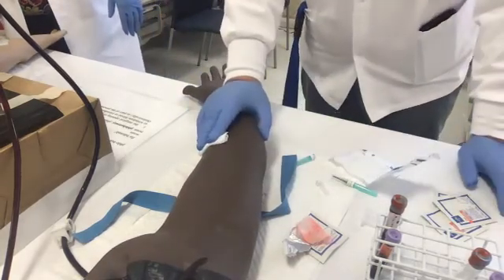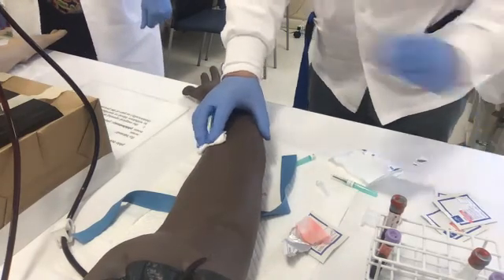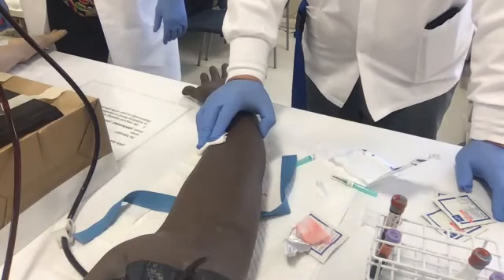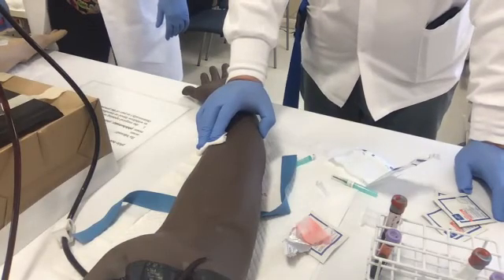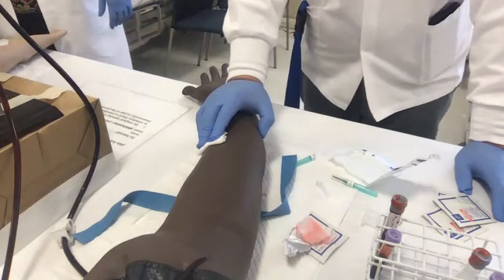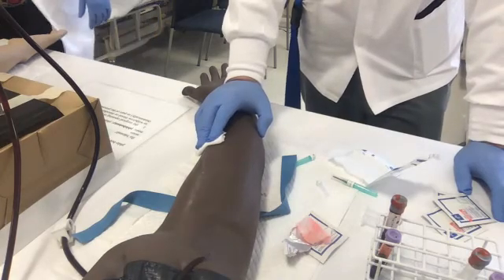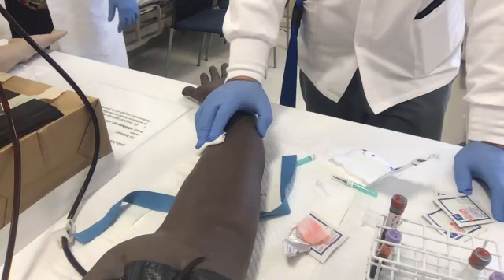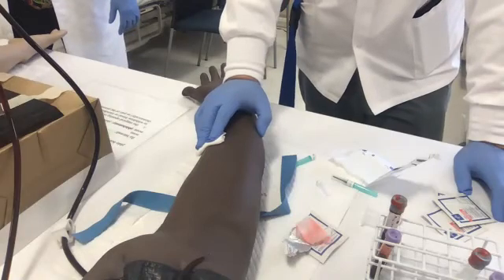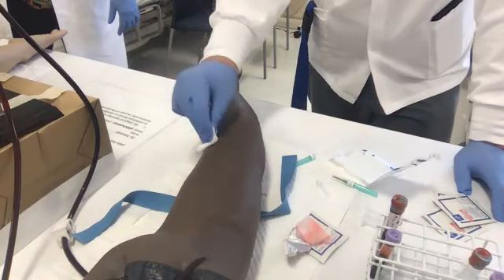Now, if for 1 more minute the patient's blood isn't controlled, you have the patient raise their arm with the gauze here to apply pressure for 1 more minute. And if that still doesn't do it, you document it and call your chain of command, and act like it's nonchalant, because it is. Odds are they're on warfarin, on Coumadin, or, like, I had a patient who said, oh, I forgot to take my aspirin. I asked them, how many did you take this morning? 3. And you're like, okay, that's why your blood is coming out like it's water. I'm exaggerating, but just know that that is the last part.